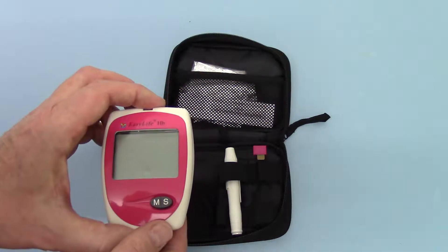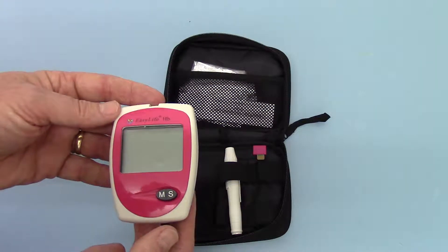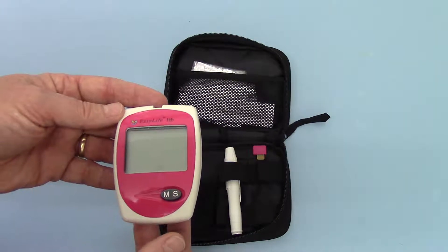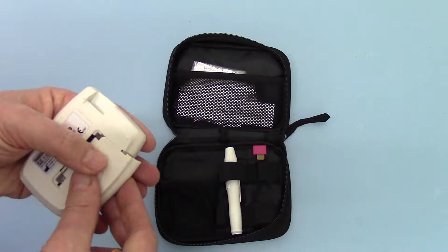This is a standalone haemoglobin meter. There is an option to buy a triple function meter which does haemoglobin, cholesterol and glucose. But to demonstrate for haemoglobin, which we're going to concentrate on today, we're just going to use the single function haemoglobin meter.